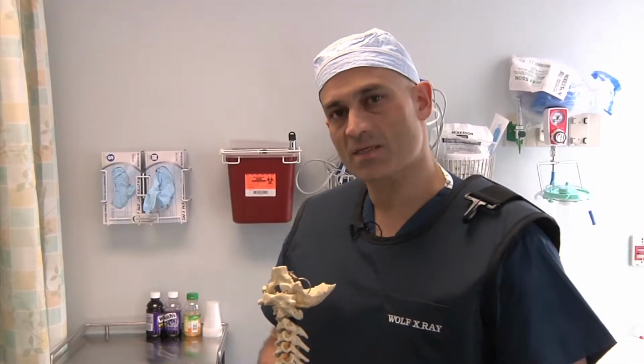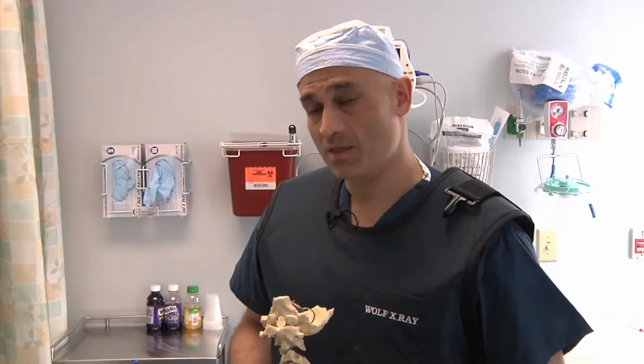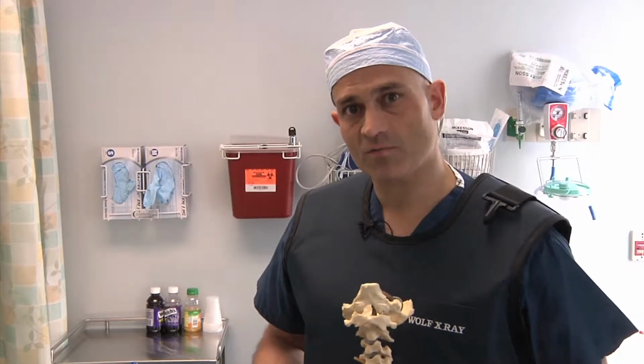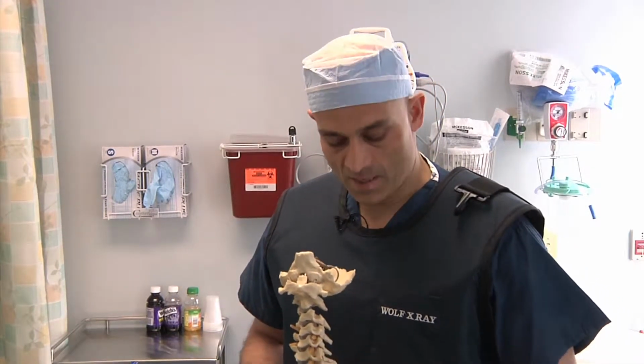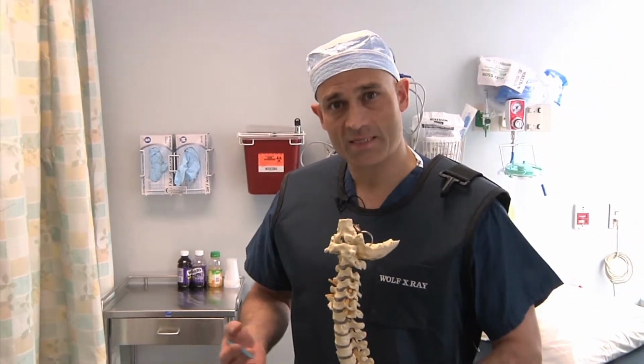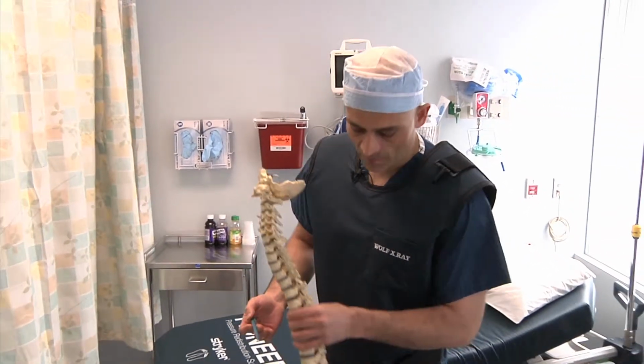Hello, this is Dr. Richard Kaul with NJSR. Today we're going to demonstrate a lumbar facet steroid injection. This is a procedure that's used for the diagnosis and treatment of lumbar facet pain. And I'm going to use this spinal model to demonstrate some of the anatomical and technical features of the procedure.